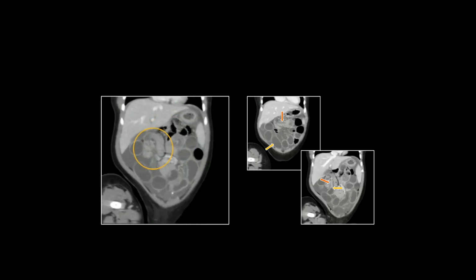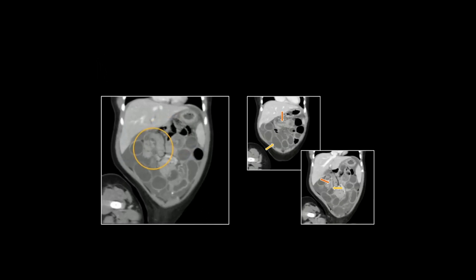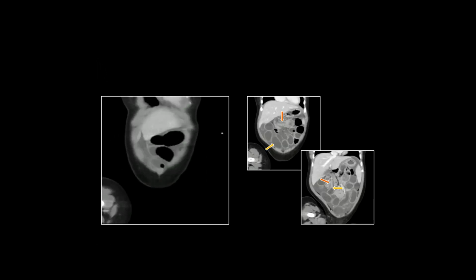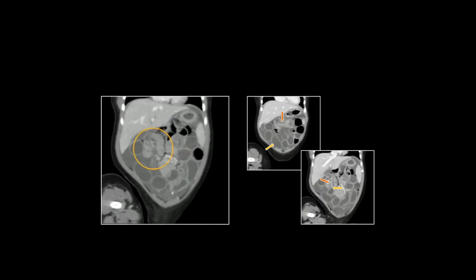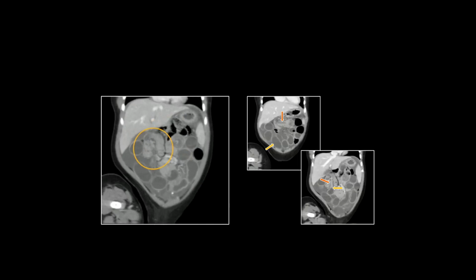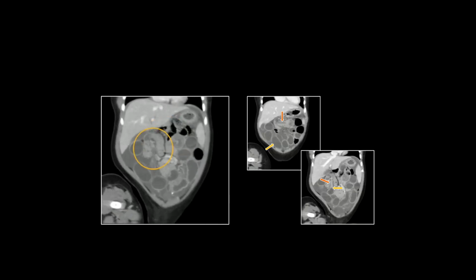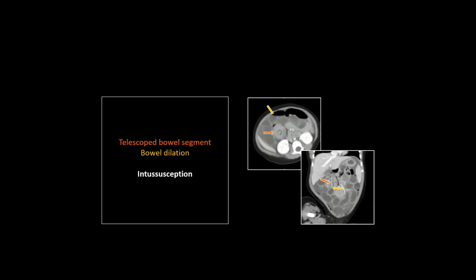All right. And remember, too, I'm sure most of you know, with children, there doesn't necessarily have to be a lead point. In fact, oftentimes they cite like mesenteric adenitis as enough to cause this. When you see these in adults, you've got to have a much heightened vigilance with regard to a potential underlying neoplasm. And in adults, obviously, if it's a lipoma, which is a very common lead point lesion, it'll be really apparent because of the fat. But in others, I've seen plenty of colon carcinomas present with intussusceptions, and it can be pretty subtle, right? Pretty difficult to separate, say, some wall thickening associated with the intussusception from an underlying colon cancer. So look very carefully, especially in adults.